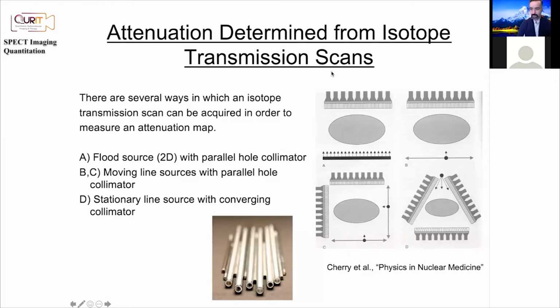So what we are having here are examples especially from before CT and SPECT were combined. And by the way, this happened in the late 90s, where SPECT CT and PET CT were combined. In the commercial world, PET CT scanners started to really quickly appear in the span of just 3 years, from year 2000 to year 2003. Almost all PET scanners became PET CT scanners, whereas SPECT CT has taken a longer time. We still have SPECT only cameras, but more and more we're having SPECT CT.